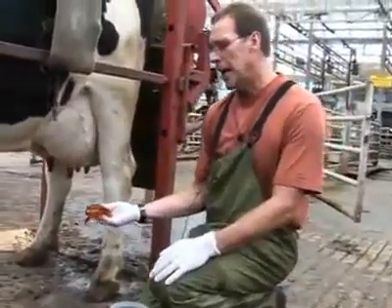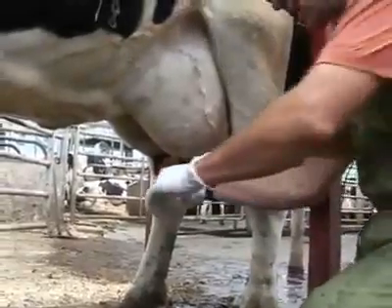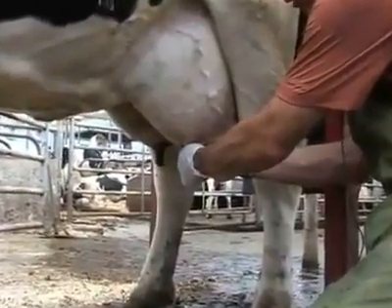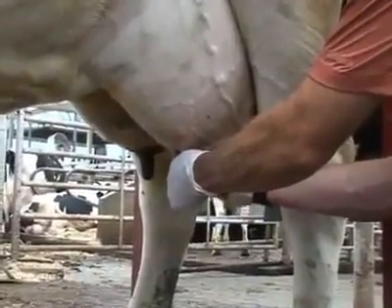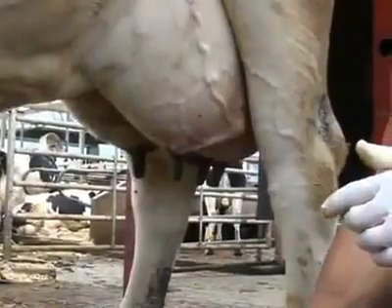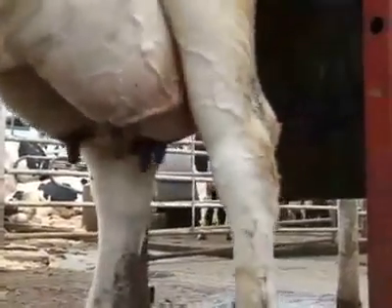What we like to first use is iodine, and what we do is we completely cover the entire teat of the animal with iodine, especially paying attention to the very teat end, aggressively cleaning the very teat end where there may be an accumulation of organic material that could cause a false positive result or a contamination of our milk sample. So we aggressively clean the teat end, and we aggressively clean the entire teat, placing iodine in place for approximately 30 to 40 seconds. We need contact time with iodine, 30 to 40 seconds.